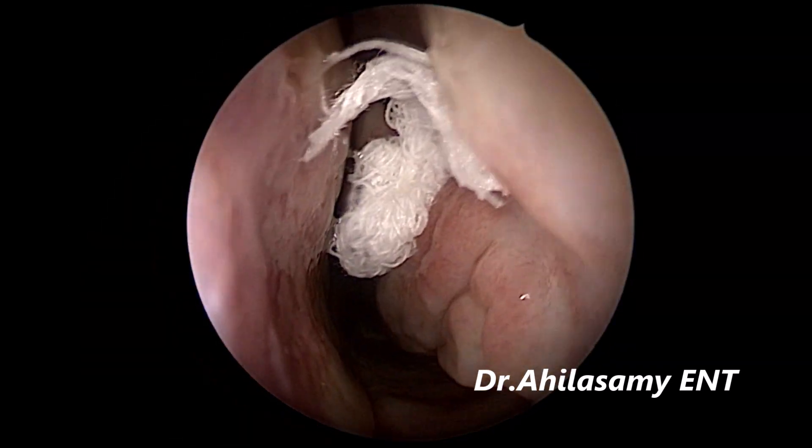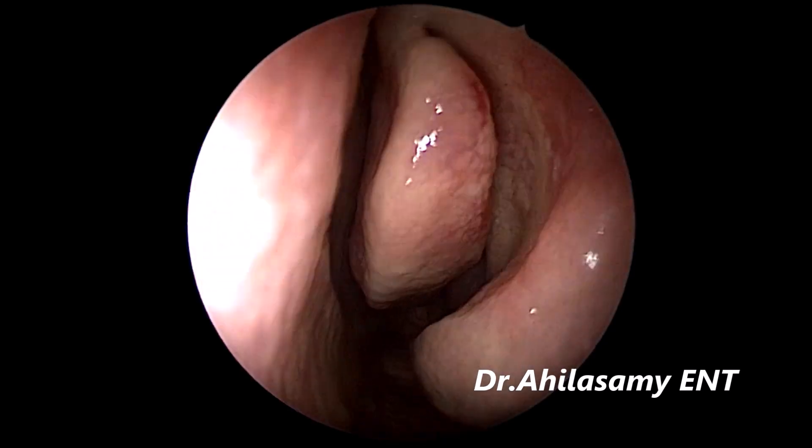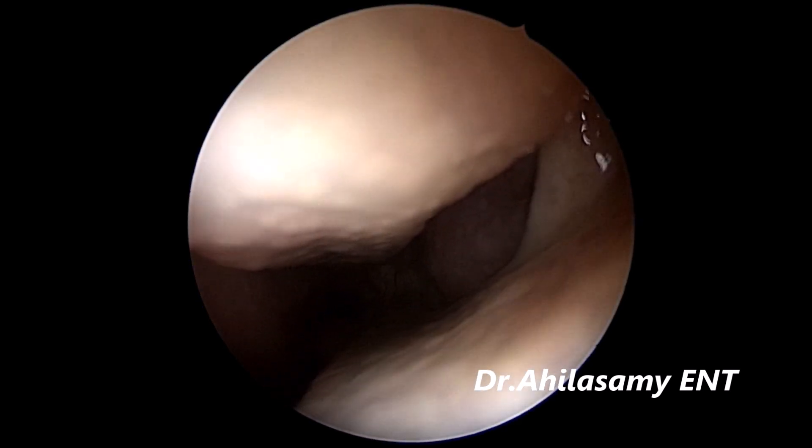On both sides packing, there is a high septal deviation on both sides, mainly on the right side. I am not going to correct it. After good decongestion, you get a good space.